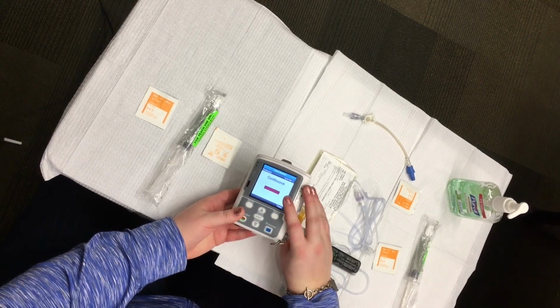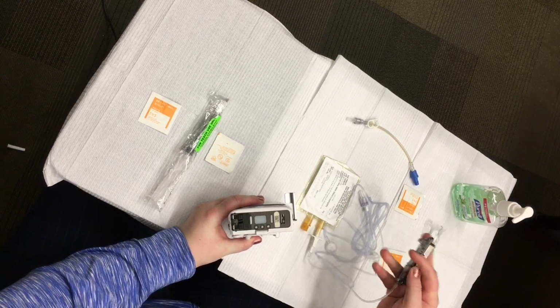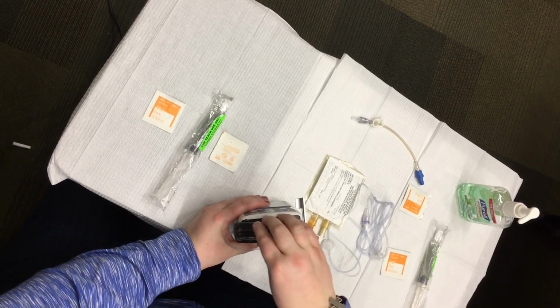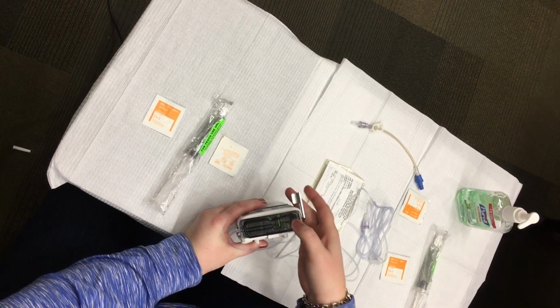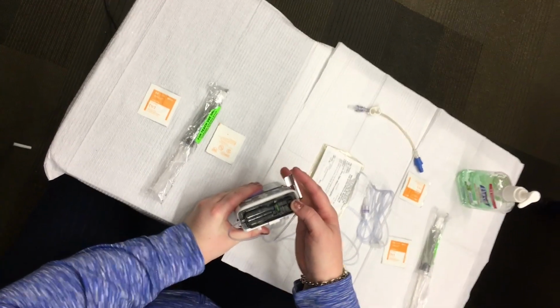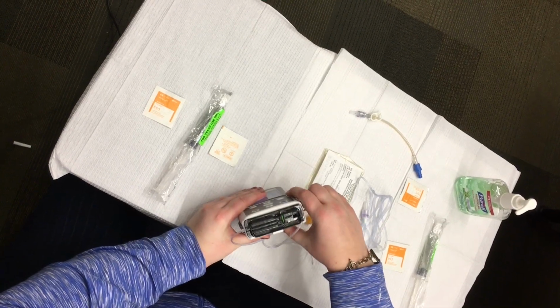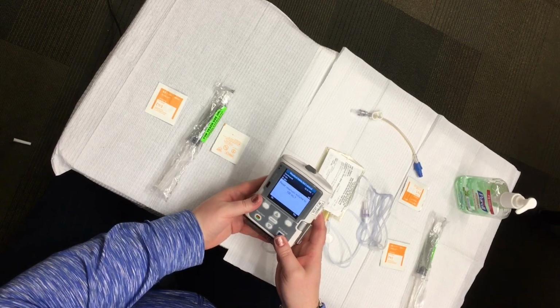Insert the plastic hooks on the cassette into the metal hinge pins on the bottom of the pump and push the plastic rectangle on the other end of the cassette into the rectangular shaped hole on the bottom of the pump. You will hear and feel an audible click when the cassette goes into proper placement. When you do, close the silver latch. If you are unable to close the silver latch, reposition the cassette and try again.